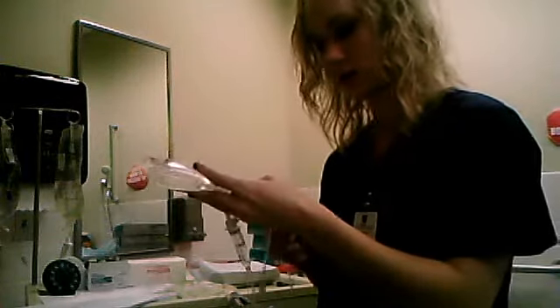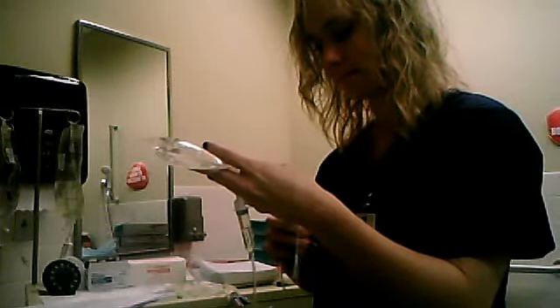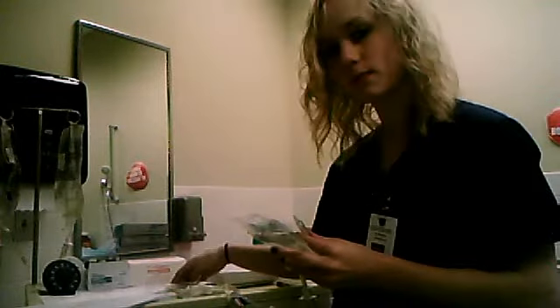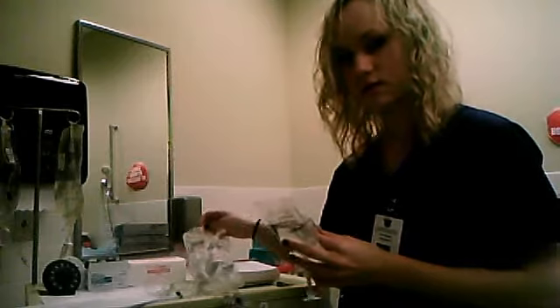So I'm going to inject this in here. And that can be discarded now. My other one is a pre-mixed bag for the slow loading dose, so we don't need to worry about that because that's already ready to go.